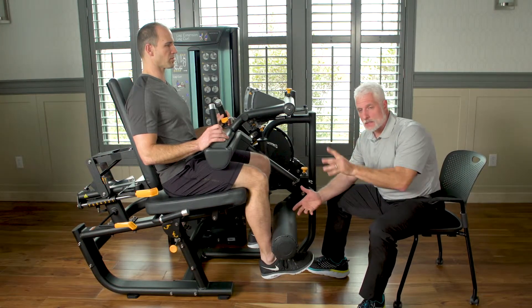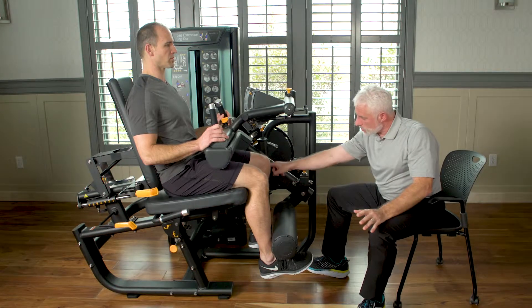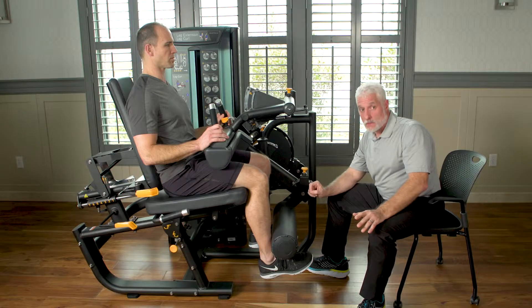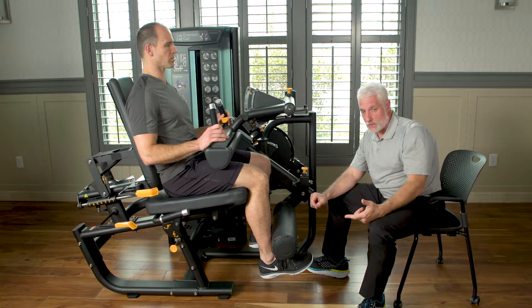On the flip side, the nice thing about this machine — which is very unique to this machine and no other — is that this joint axis will line up with the joint space. For flexion, this also works by one switch of a knob. We're going to demonstrate and show how we do that.